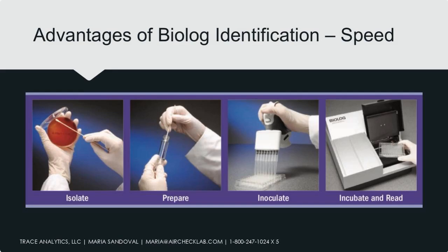We'll put it in this extraction liquid. We'll make sure the turbidity of this liquid is perfect for the inoculation of the 96 well plate. We'll put the 96 well plate in the incubator and we'll run it the next day. So that's about a 24 hour turnaround for bacteria. It's a little bit longer for the eukaryotes like fungi and filamentous fungi or yeasts, but that's because they're systematically different. You have eukaryotes or prokaryotes.